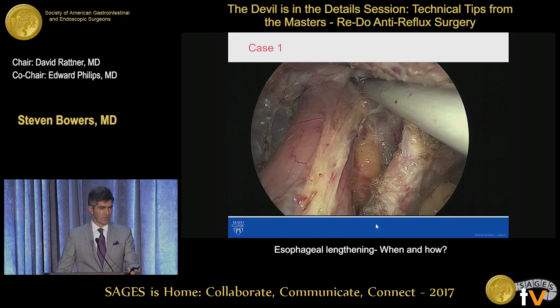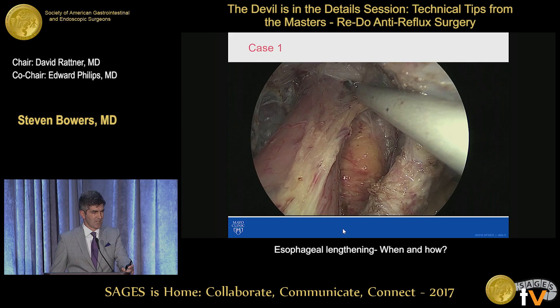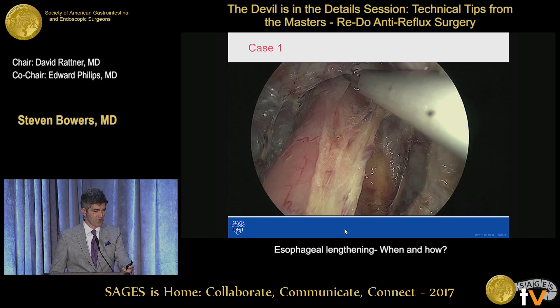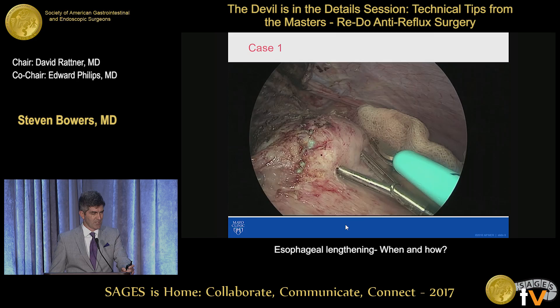So now we're into the mediastinum, and we'll do a complete mediastinal dissection. Really in these cases — the short esophagus — we really wanted to dissect all the way up to the pulmonary hilum in that plane between the pericardium and esophagus, up to where you can see the inferior pulmonary veins. And then you get somewhat diminishing returns trying to go higher than that. But in this patient, we're really concerned about the foreshortened esophagus, so we want to really maximize our intra-abdominal esophageal length.